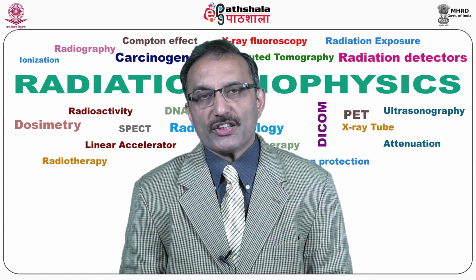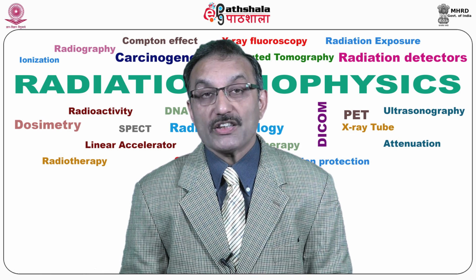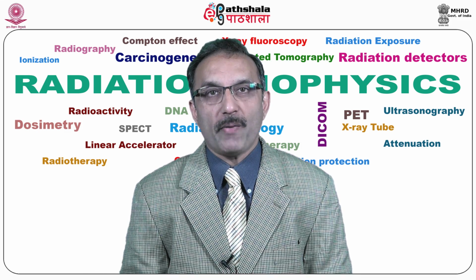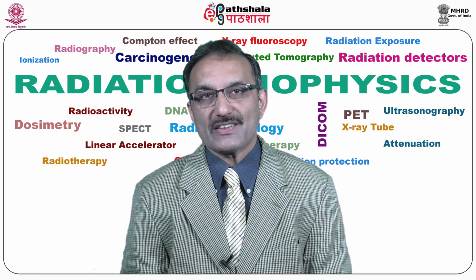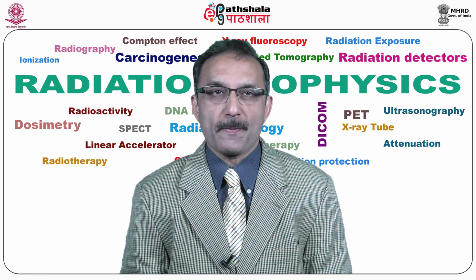When we talk about the introduction of this particular topic, the first thing which comes up is, what is nuclear medicine? Nuclear medicine is a branch of medical imaging that uses radiopharmaceuticals to examine the function and structure of organs and tissue.